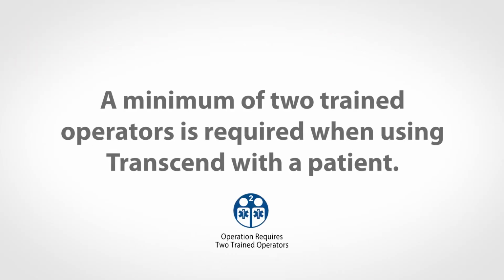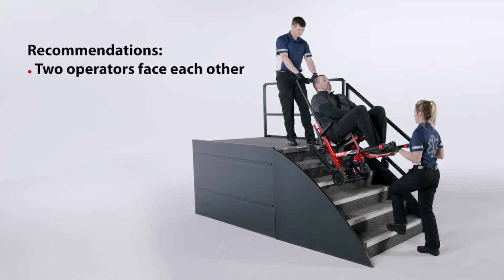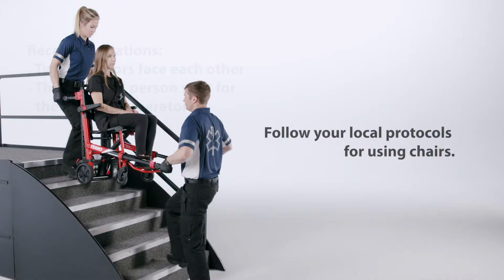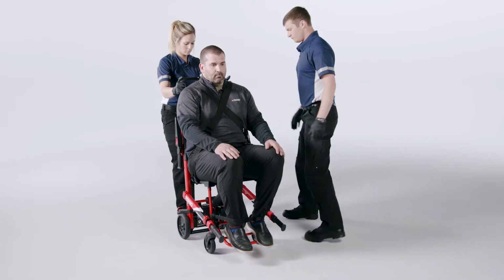A minimum of 2 trained operators is required to use the Transcend chair with the patient. It's recommended that the 2 operators face each other when transporting a patient on the stairs, and that a 3rd trained person spot for the foot end operator. Follow your local protocols for using chairs. Verify the patient is properly restrained before transporting a patient upstairs.